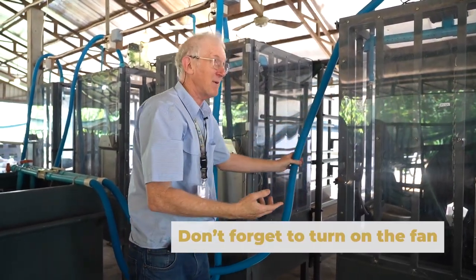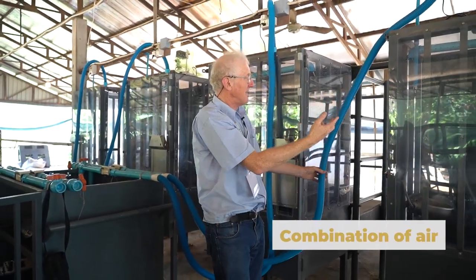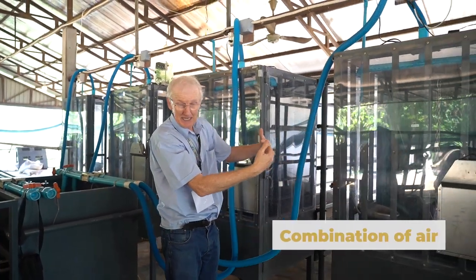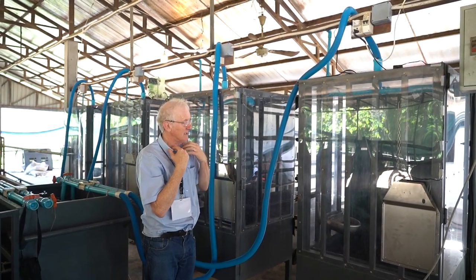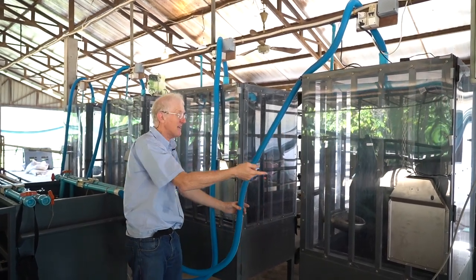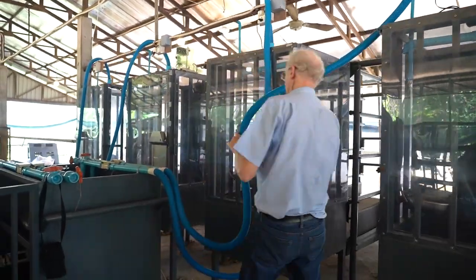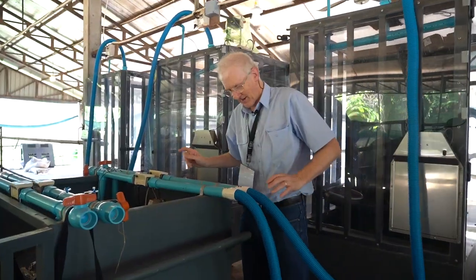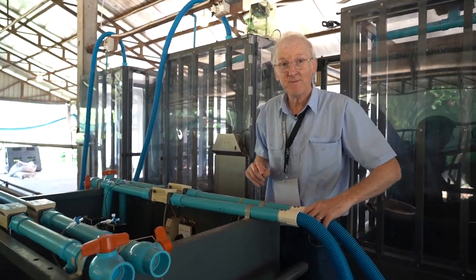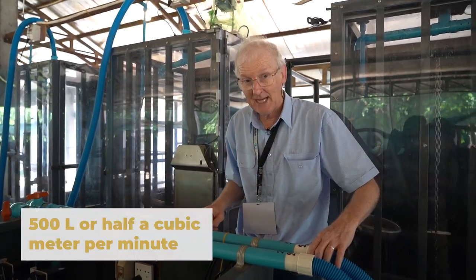But now air is coming through here, and that air will be a combination of the air that has been drawn in around the cow's neck. There's a loose fitting collar or shroud that we'll see in a little while. So the air is coming around the cow's neck, mixed inside there, and coming along here. We're going to need you guys probably to come over this side for photo. So this is our air, maybe 500 litres or half a cubic metre per minute flowing along here.